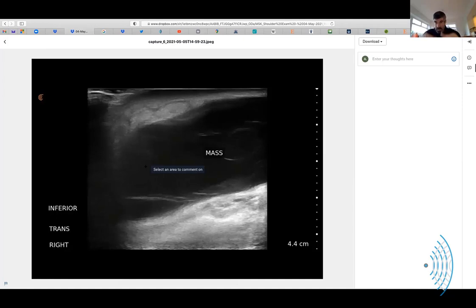Now it can be edema, it can be all sorts of things, but that shape is not a new shape. So the reality is it was reassuring to see that there was a line. It was the way that you could say, likely not sinister, Greg, because there's a line of where this was fed, and it's not that this grew from within its own area. That's helpful, John. We would have looked at this and said it's probably a hematoma anyway.